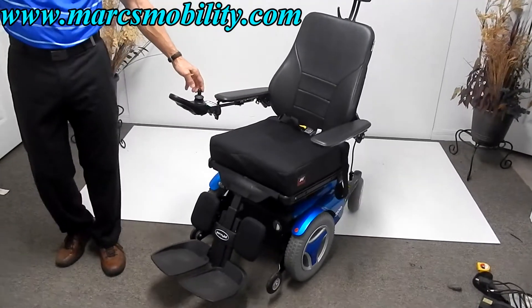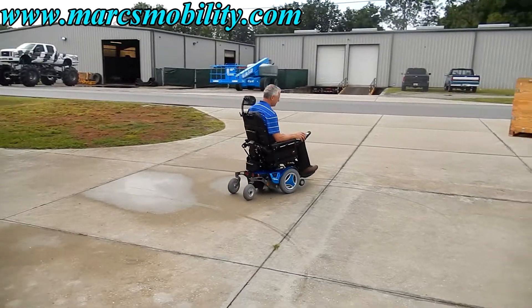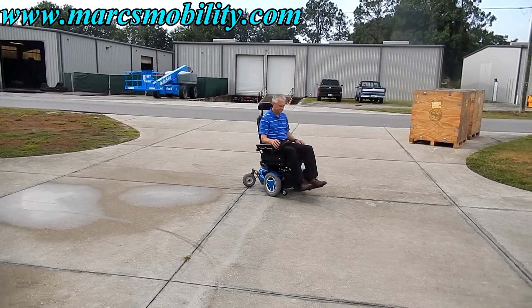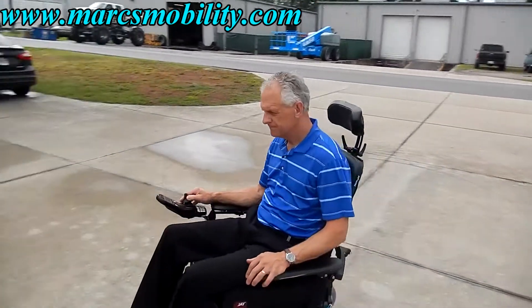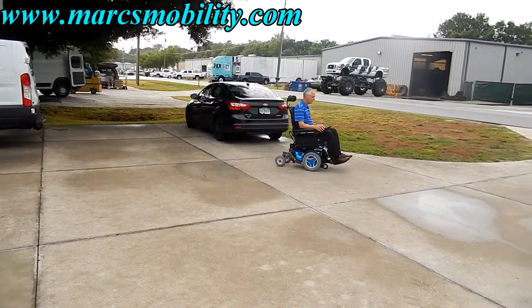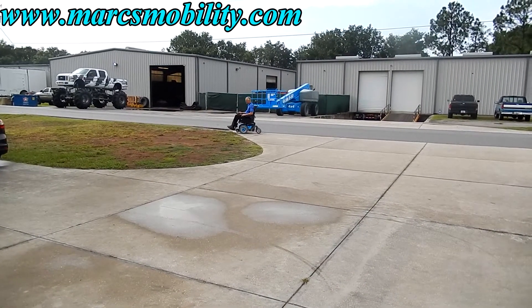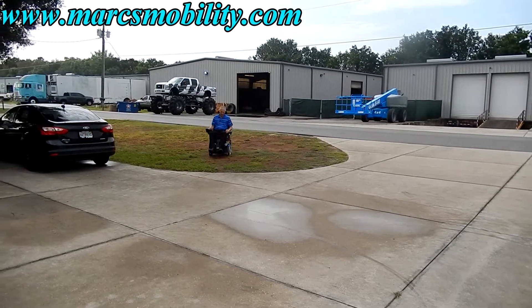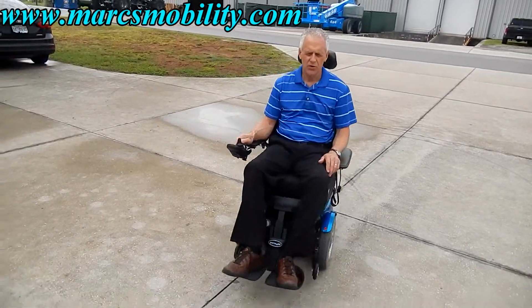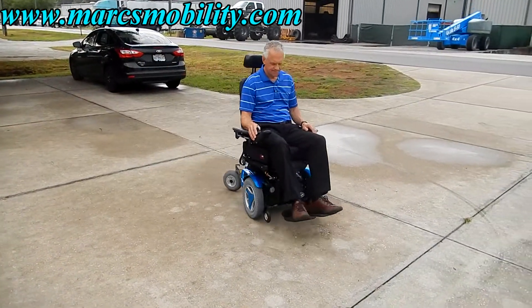This chair is ready to go and will do five miles an hour. You can't even hear it when it drives — very nice chair.